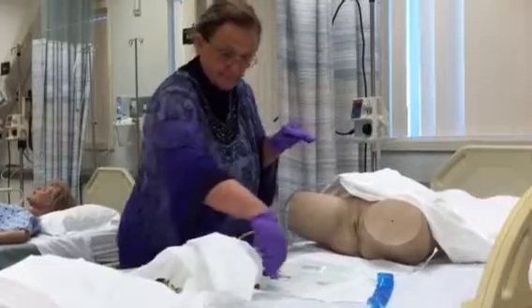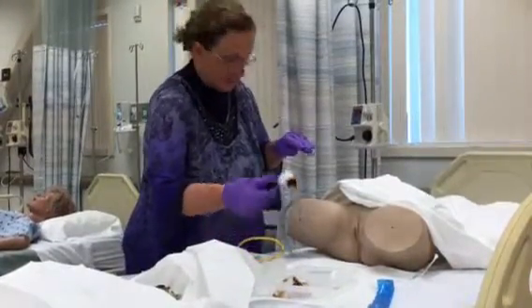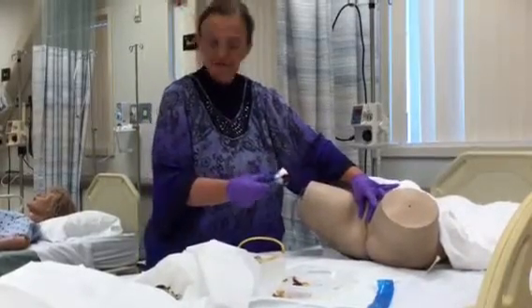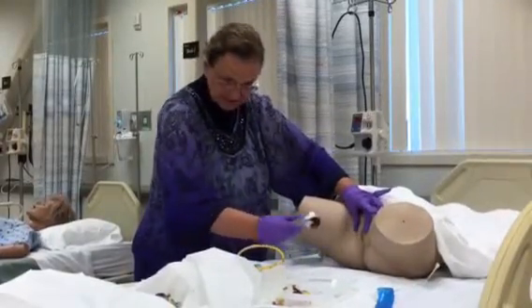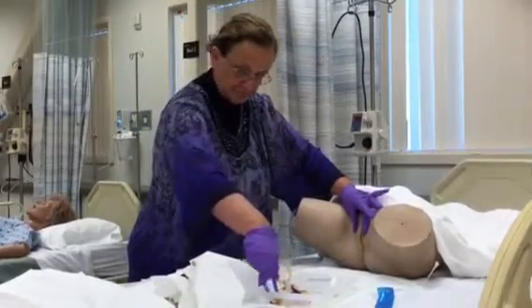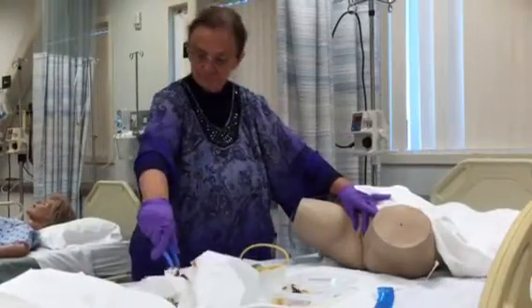All right. So then I take my cotton swabs, and you clean away first. I don't want to stain the mannequin, so I'm just going to simulate it. So I lift up the labia, and I clean away, and I dump. See how the dump goes? I clean towards, and I dump.